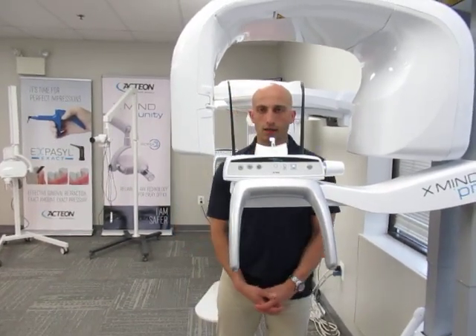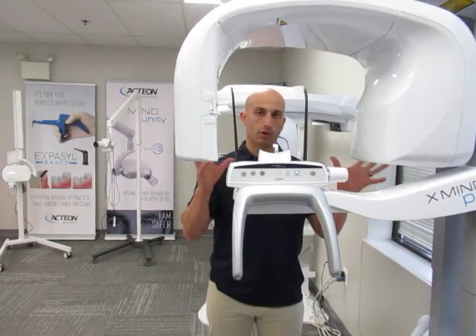Hi, I'm Dustin DiMercurio with Acteon. This video is to go over the components of Prime.